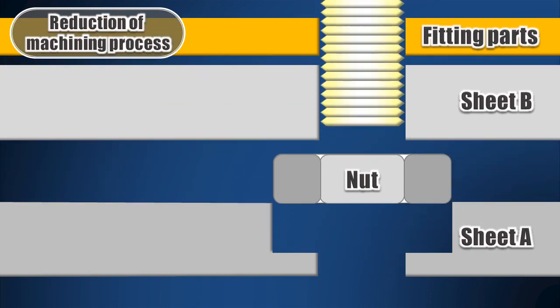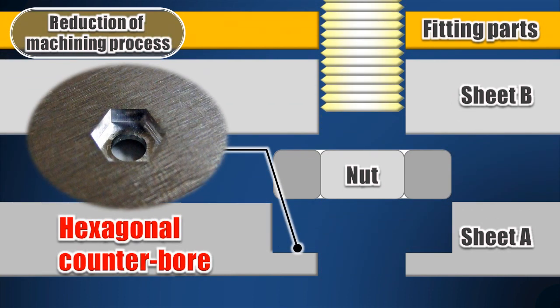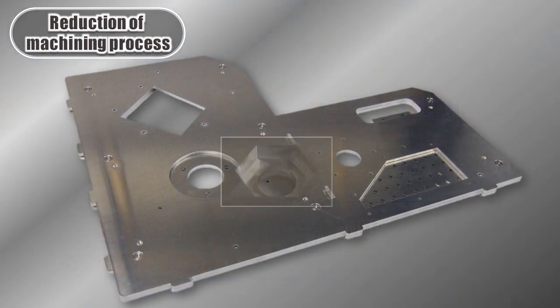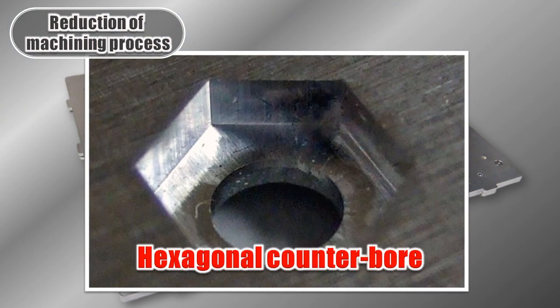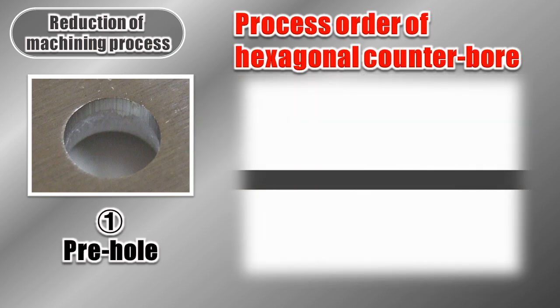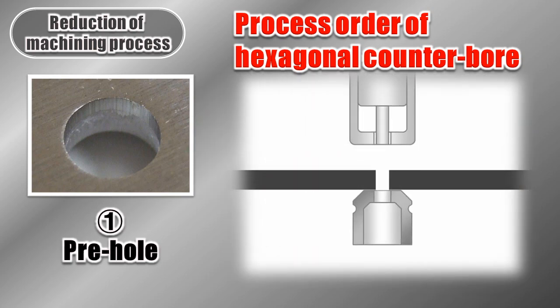Over here, we use the laminated structure to insert a nut between the 2 sheets to replace the tapping. The hexagon counter bore is made during the blanking process. It is processed in 3 steps in the order of pre-hole, pressing, and size finishing. When you see how it is processed in animation, it looks like this.